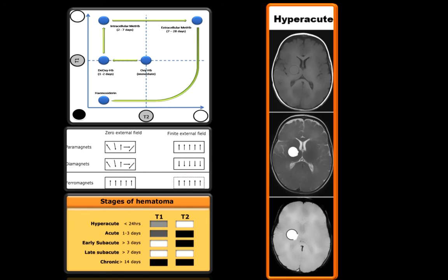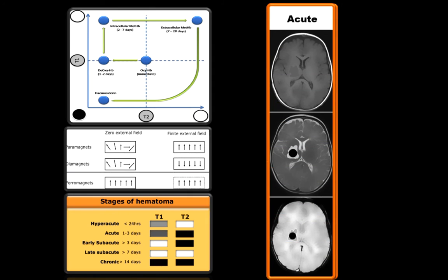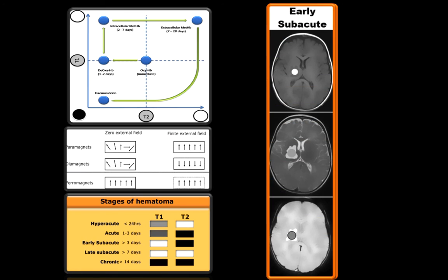Now let's review the graph again. The central part represents the immediate or hyperacute stage — the blue dot in the center means it will be isointense in T1 and slightly hyperintense in T2. In acute hemorrhage, the blue dot is near the T1 line, meaning it will be isointense in T1 but the T2 level will be very low and hypointense in T2. In early subacute, it will be hyperintense in T1, as methemoglobin is still intracellular.